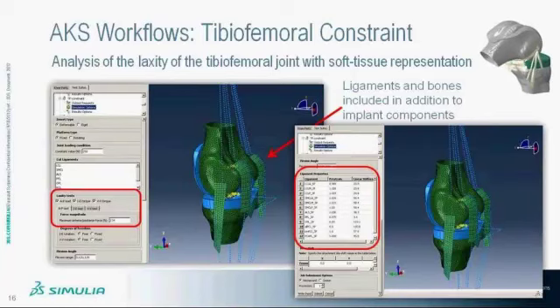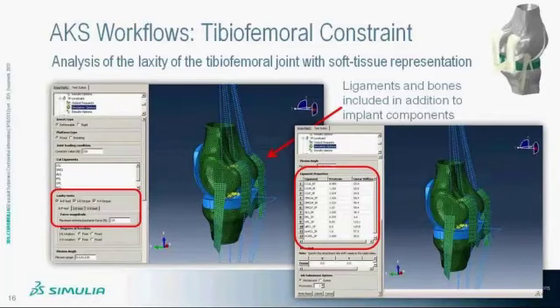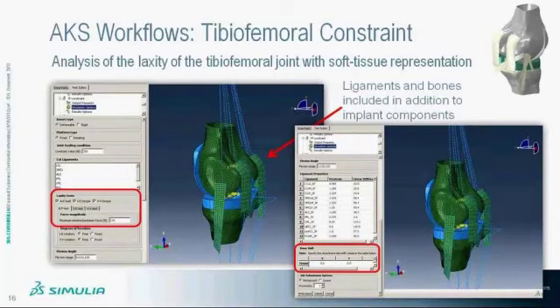Provided along with all the ligaments is control over the ligament properties. Ligaments are pre-strained in all these simulations. The user can control the amount of pre-strain, and the user can also scale the linear stiffness of these ligaments. Although they are non-linear, we provided the scaling for the linear stiffness portion. The bone components in this workflow can be shifted.